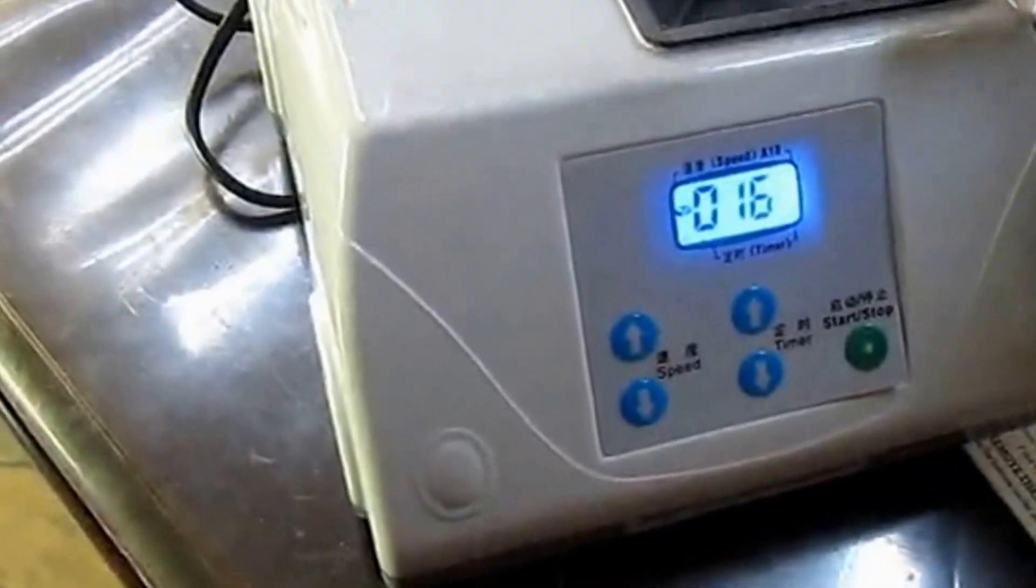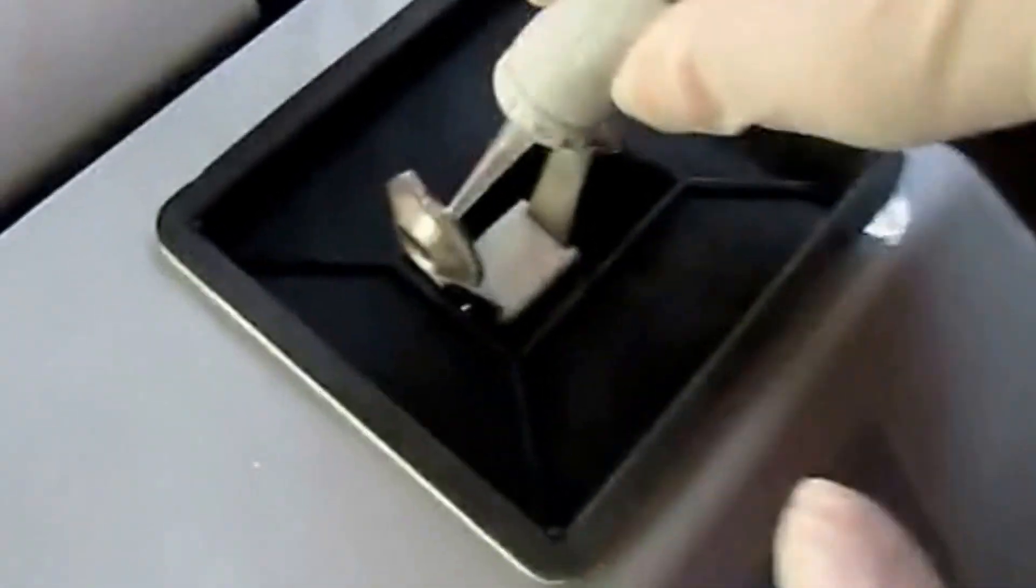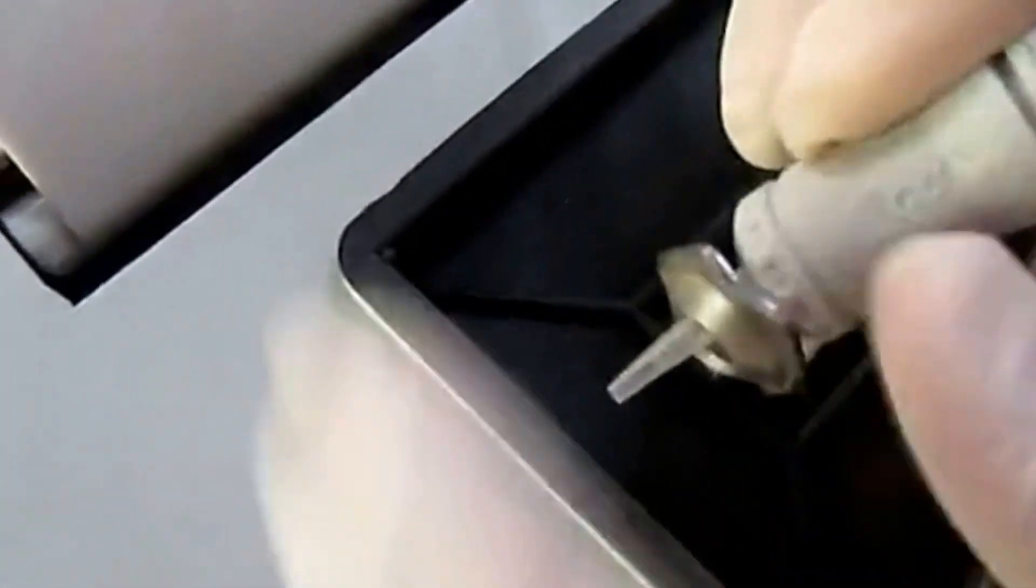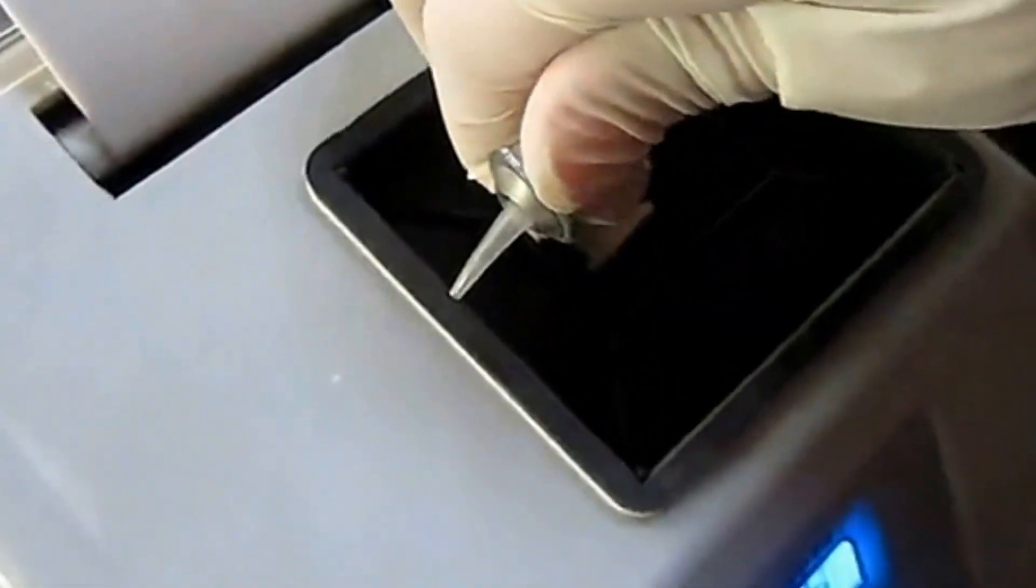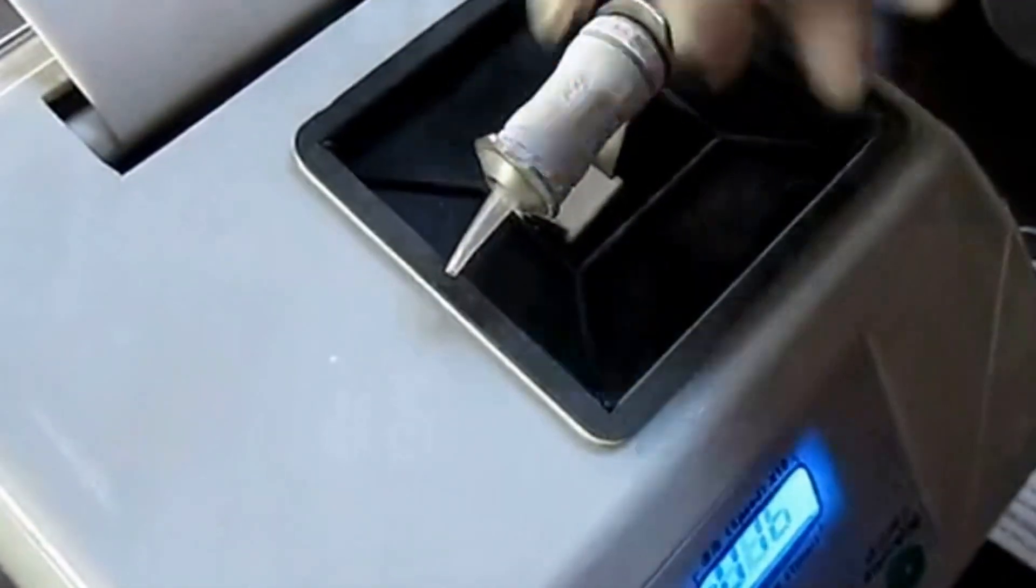Please follow the steps to load the glass ionomer or amalgam capsules. For glass ionomer capsules, place the capsule with the tail pointing downward when putting it in the amalgamator.